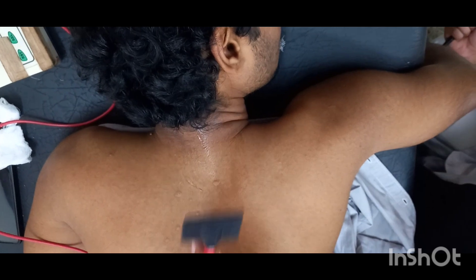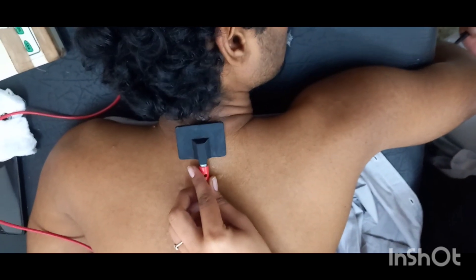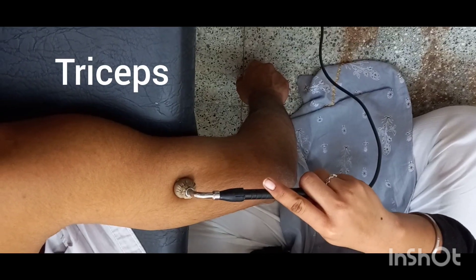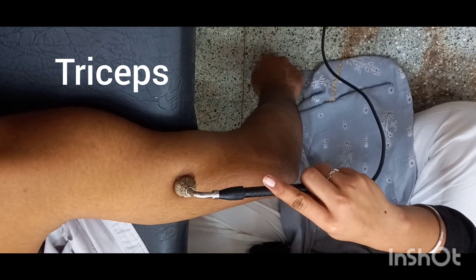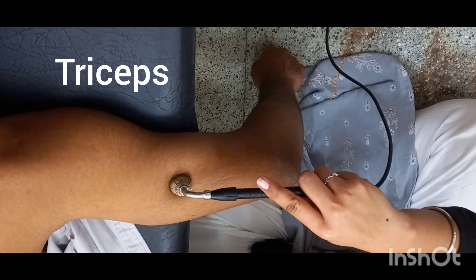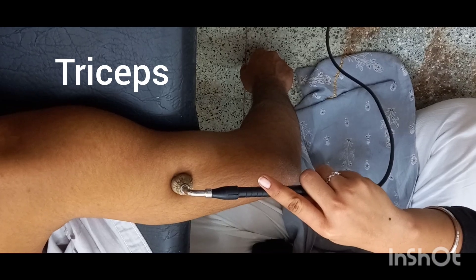Radial nerve. Anode placement over the cervical region, pad electrode. Radial nerve, first muscle: triceps. Muscle action: extension of elbow.